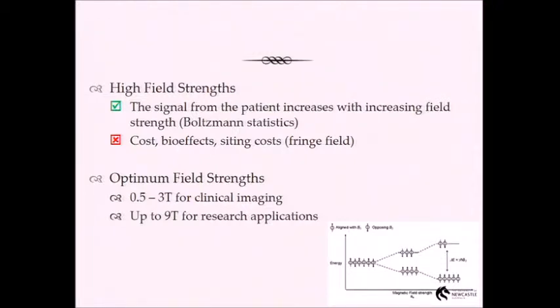The contrast media that we use in MR is a gadolinium ion, and it's always been considered to be safe. And in the last 2 to 3 months, there's a hell of a lot of discussion going on, mostly coming out of the European Union, about how safe gadolinium is, because it has been known to cause severe effects in some people with their kidney function. It's called NSF, nephrogenic systemic fibrosis.